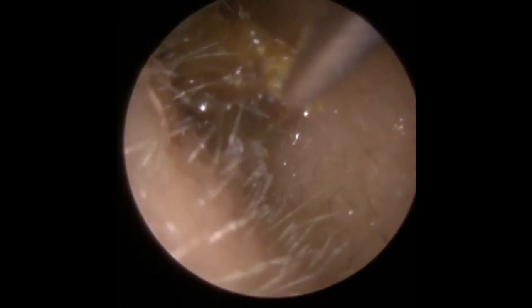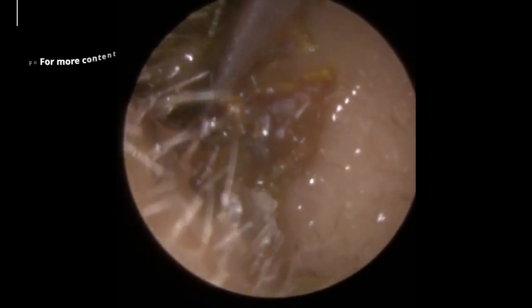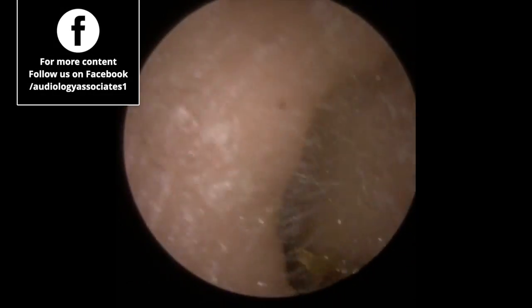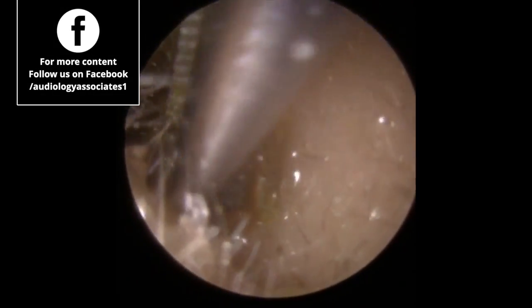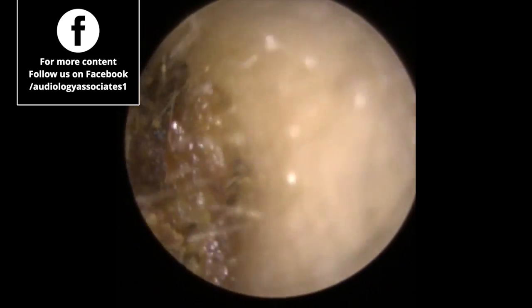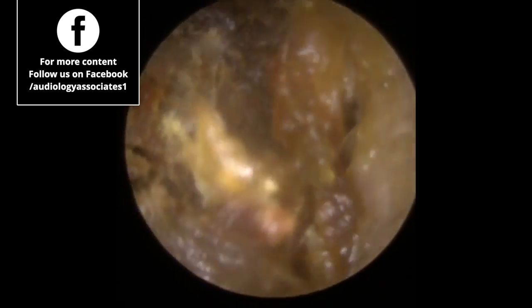I'm trying to get from above to either side of this big block of wax because it is a fair old size. You can't see that at the moment, but when you look a bit further in the canal, you can see that it goes down quite a way. There's a little bit of dry skin at the entrance, so I'll just get rid of those pieces first — it just helps with my view a little bit.